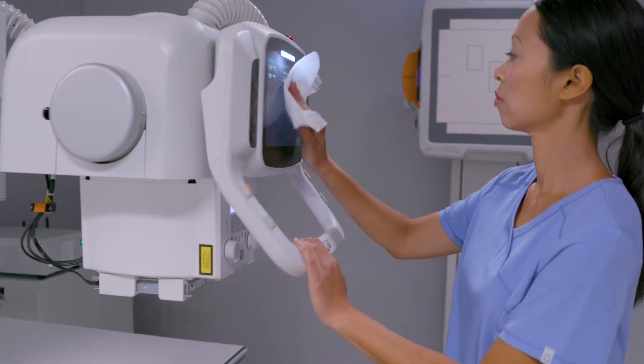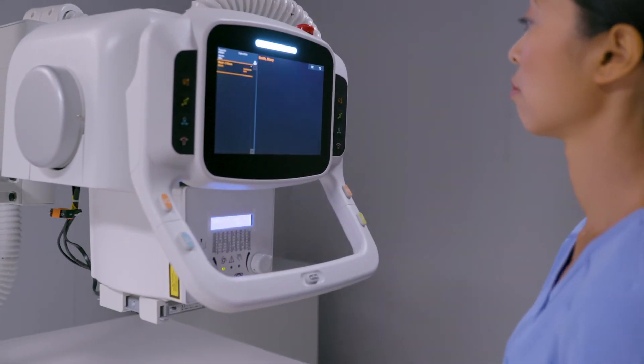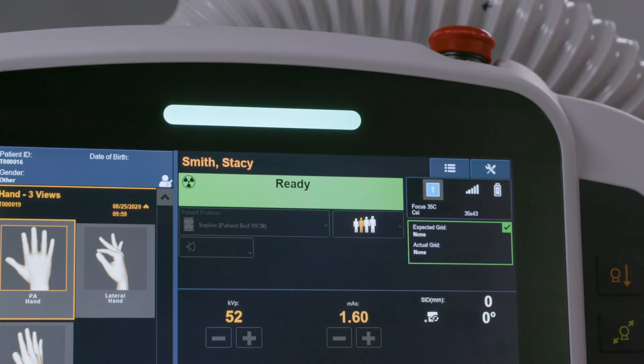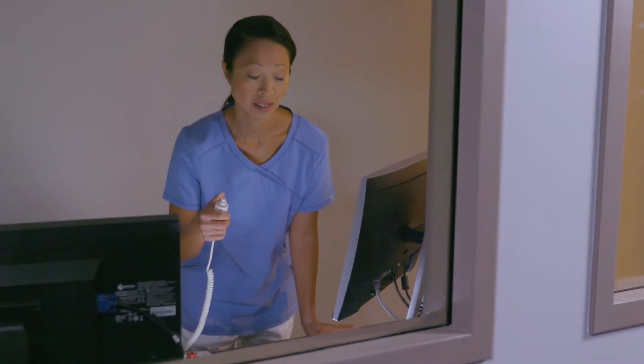The flat screen allows for easy cleaning — that's critical today. The LED lights on the tube head and wall stand are really useful indicators. I know when the system is ready because I can see it from anywhere in the room, even from the control console.